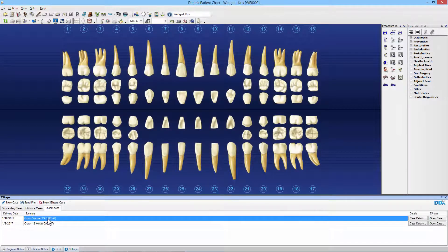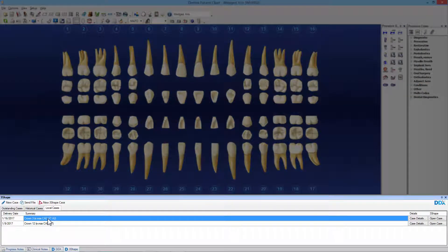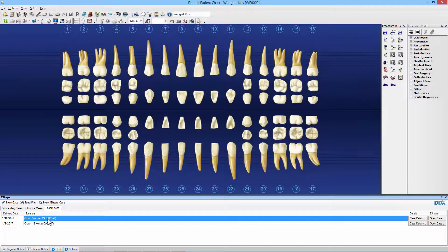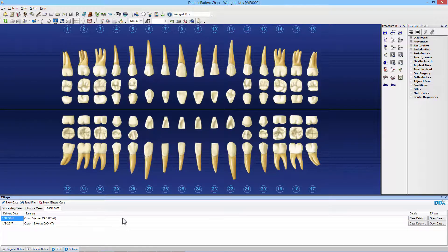The case information is transferred to the patient chart in Dentrix and the TRIOS case will be listed in the 3Shape panel. In this panel, you will see the list of all 3Shape cases carried out for your patient. To view the details of each specific case, select it in the list and click Case Details.